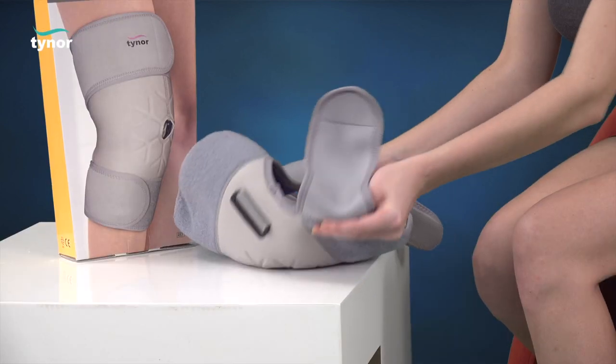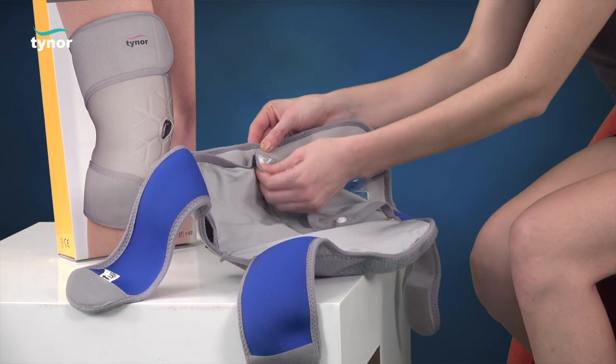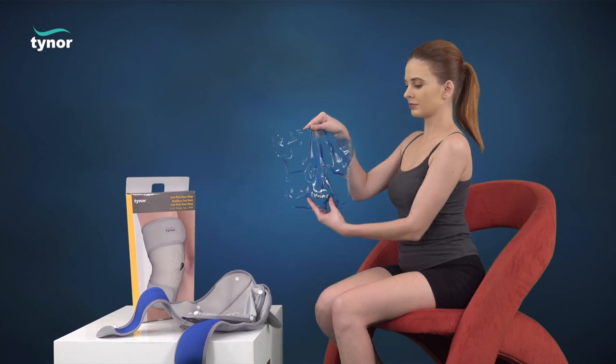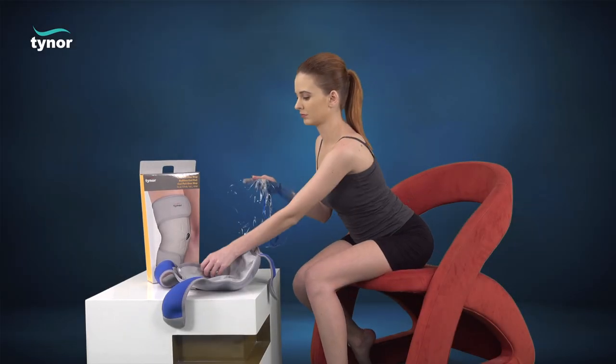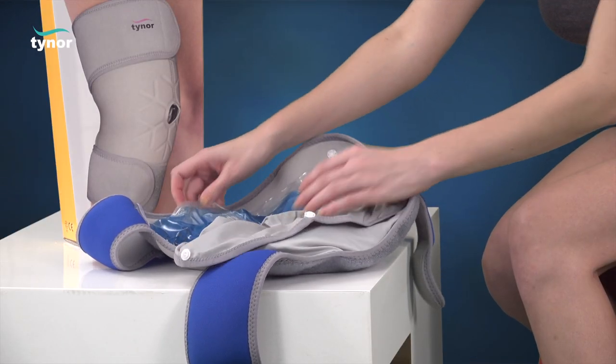Take out the cool pack from inside the fabric cover. Preserve the cool pack in the freezer at about zero degrees for a minimum of one hour. At the time of use, remove the cool pack, place it in the cloth cover, and use immediately.